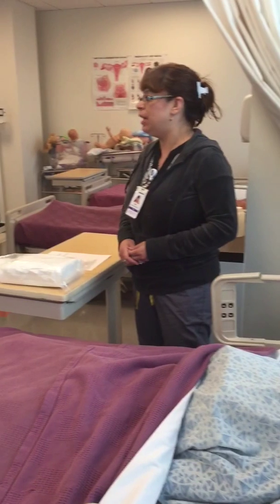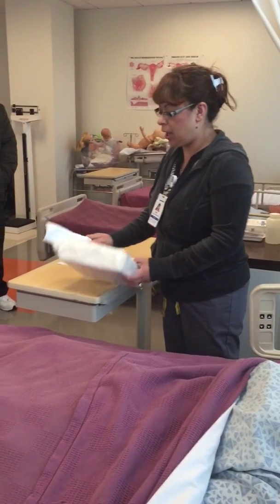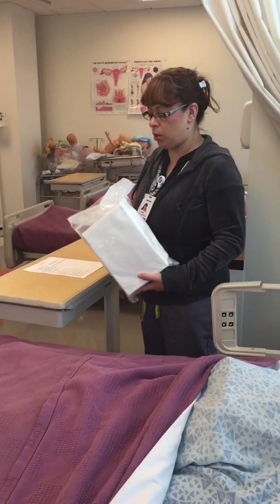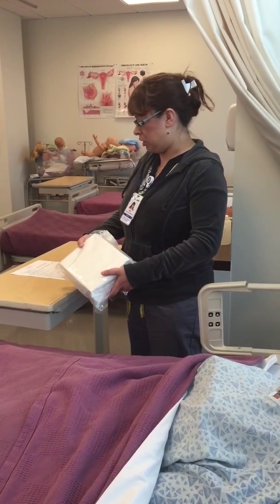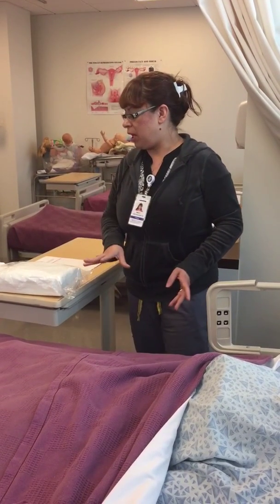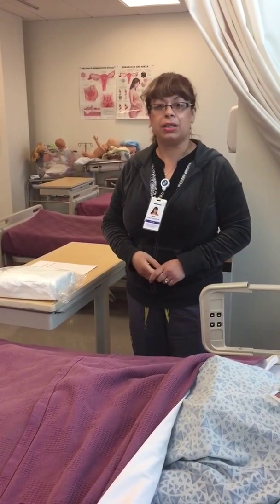So you want to explain it, and of course you want to provide privacy, and you want to make sure that when you grab your kit, your kit will have the expiration date. You want to look around your package, make sure that there's no interruption to the integrity. In ours, I'm recycling, so it's going to look like this, but yours will be brand new when you open it. So I already washed my hands. I explained the procedure to the patient. I'm going to provide privacy, so I'm going to close the curtain, and we're going to go ahead and start.